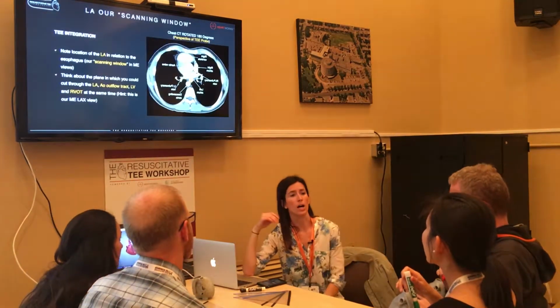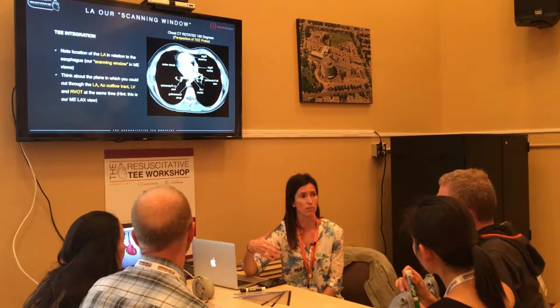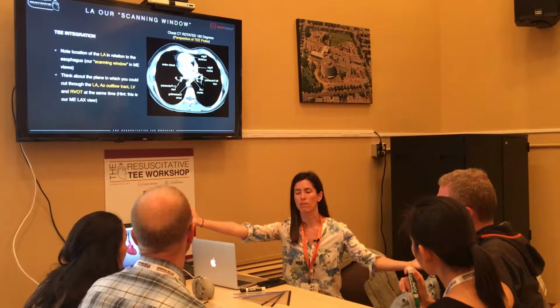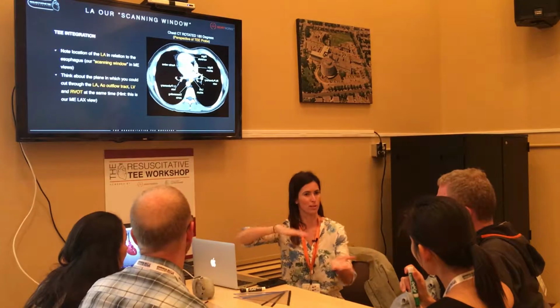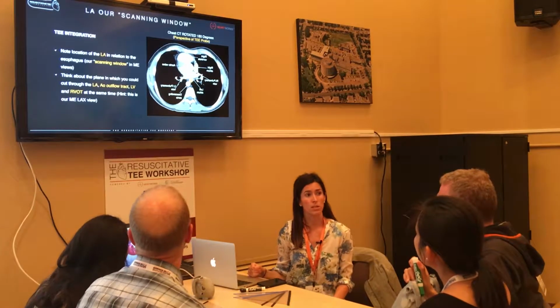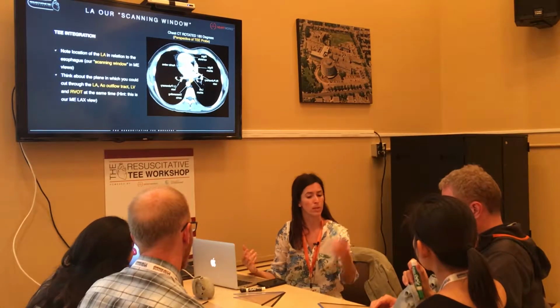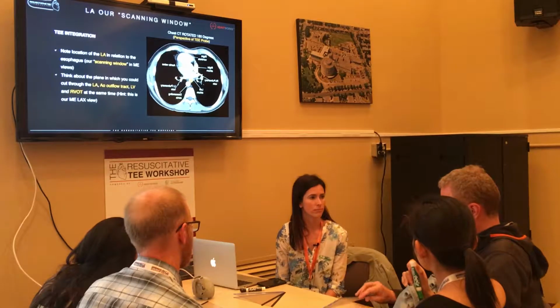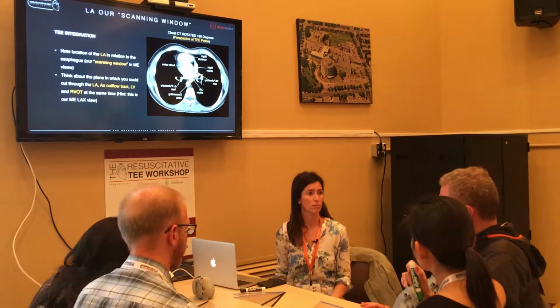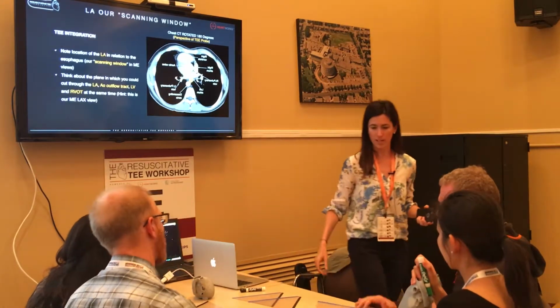One of the points that we want to make about the mid-esophageal views, those are 3 of the 4 main resuscitative TEE views, is that the left atrium is our scanning window to the world and the heart, okay, within those particular views, all right? As you can see here, the left atrium is closest to the esophagus where the probe lies. So if I was to give you this vector here, can you draw for me where you might see the left atrium? Exactly. It's going to be in that near field because it's closest to the probe. Perfect. All right. I'm going to switch over to this HeartWorks computer. In the meantime, everyone take a vector.